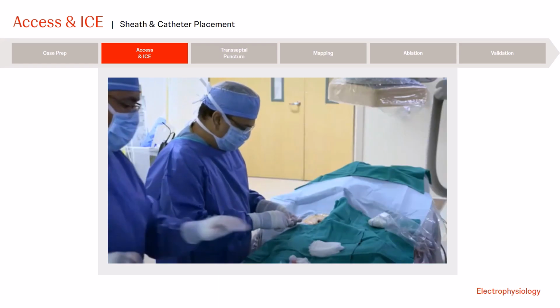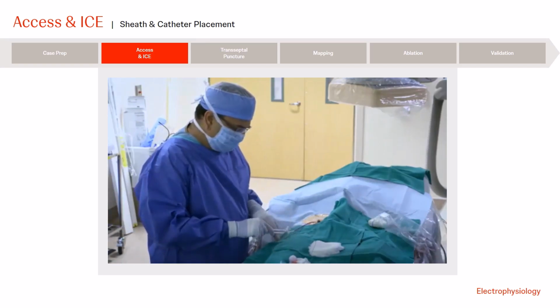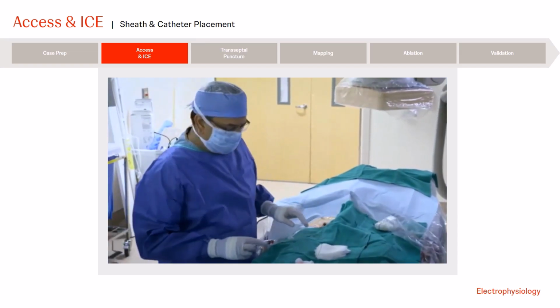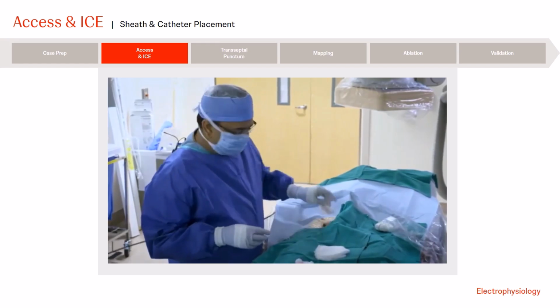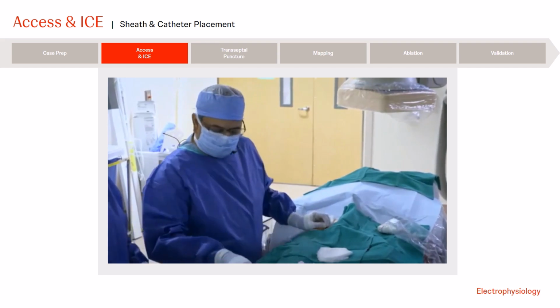Can we give the patient 10,000 of heparin, please? The patient has been anticoagulated. They're taking Xarelto. Their last dose of Xarelto was yesterday evening, so it's basically uninterrupted, or it was yesterday. And so our protocol is typically to leave the patient on anticoagulation.